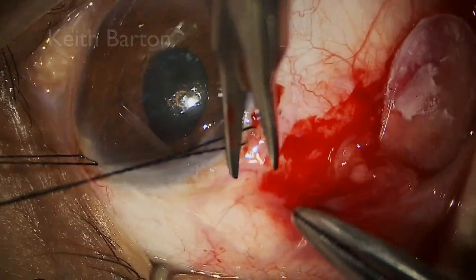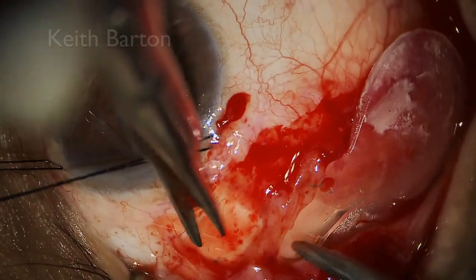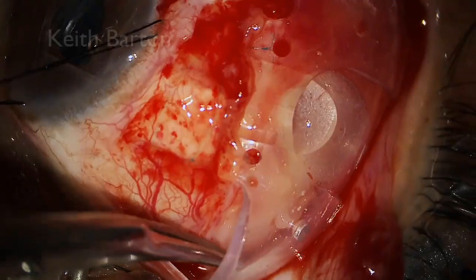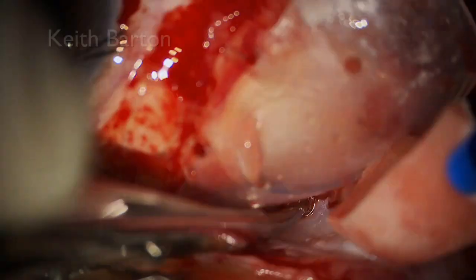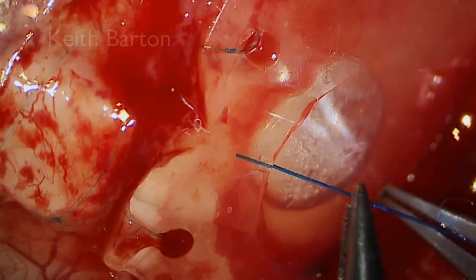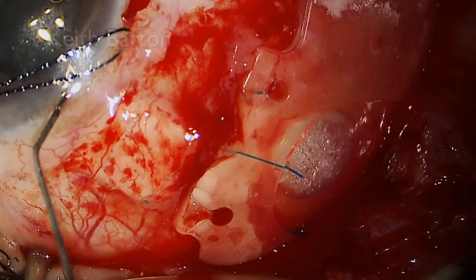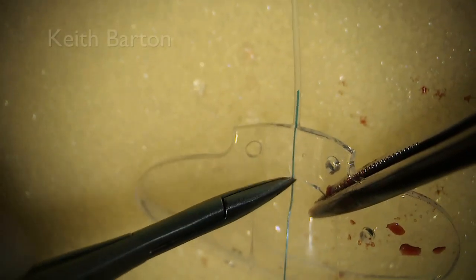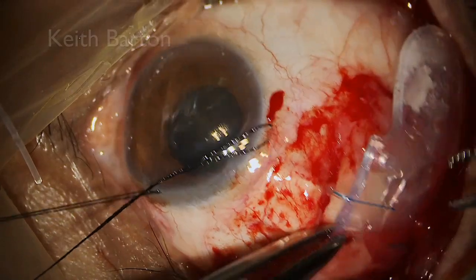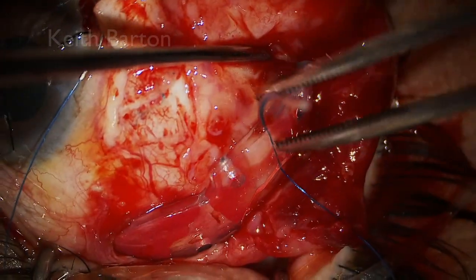Obviously, it had to come out, but the issue with plate erosions is you often have a lot of scarring in a pool of blood, which this wasn't because it was early, but you've got a mucky plate that needs to go because there's a risk of infection. And the question then is, do you replace it with something in the same quadrant or another quadrant, or you just pull it out and don't do anything? I replaced this with another one in the same quadrant for a couple of reasons. One is that the plate was mucky but there was really no sign of infection. He was vehemently opposed to having more than one operation, in other words, closing it and doing another one later.